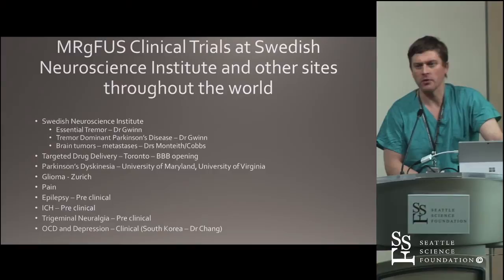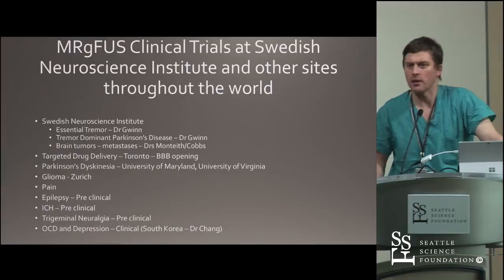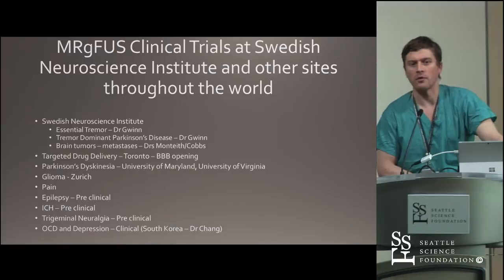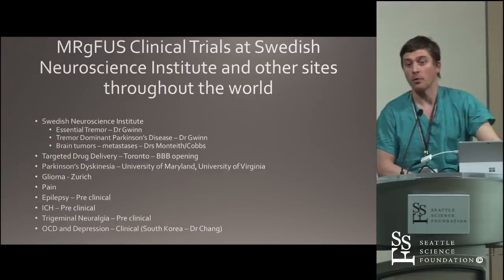So that was a nationwide pivotal FDA trial that basically went on the back of that pilot study, and all of those patients have been treated, and the results of that trial will be released shortly, I believe at the next AANS meeting. So we're eagerly awaiting those results. That was a sham controlled trial. So patients were treated with shams. They were put in the magnet, were treated. They didn't know if they were treated or not. And then at the end of the procedure, they would say whether they thought they had been. And if they were not, they were crossed over later and were treated.